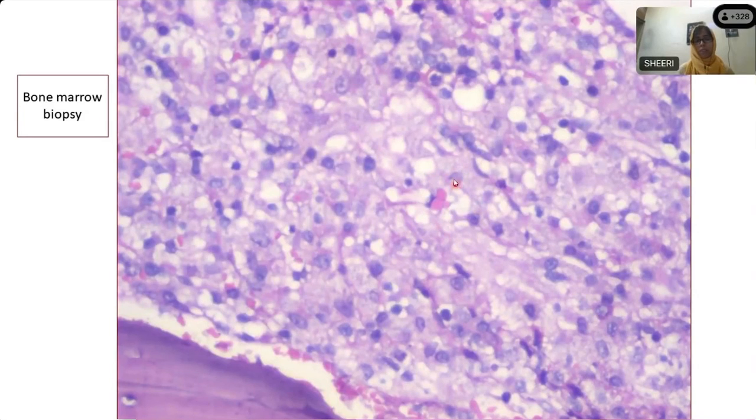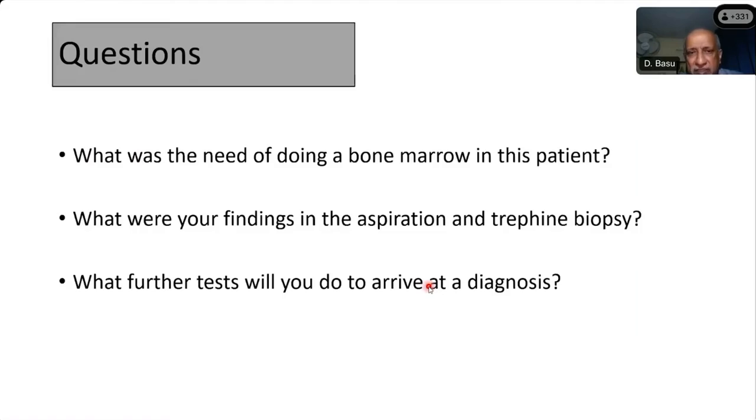Plasma cell, maybe Russell bodies. What are these structures called? Russell bodies. Right, they're Russell bodies. So there are Russell bodies, and overall there is suppressed hematopoiesis. Right. I don't see too many hematopoietic cells. I'm seeing these sheets or clusters of these bubbly, foamy sort of macrophages.